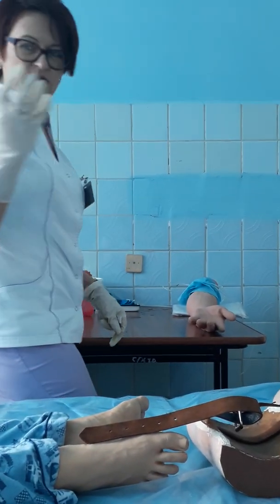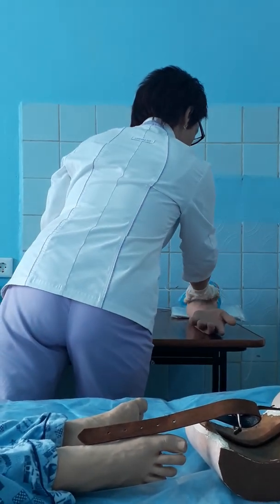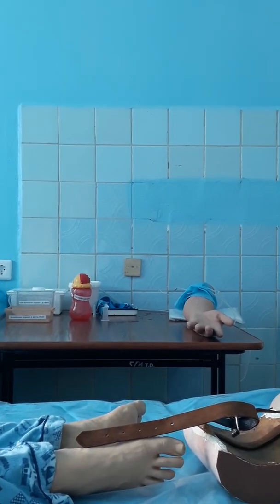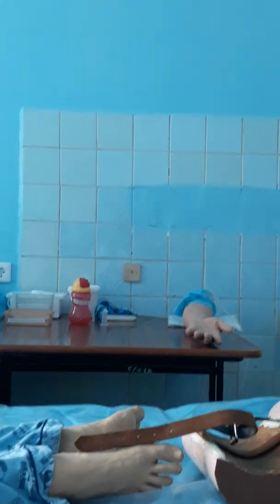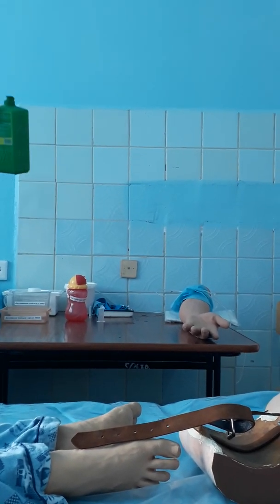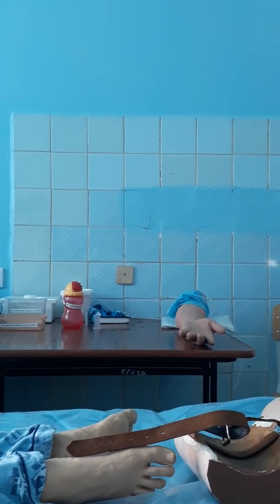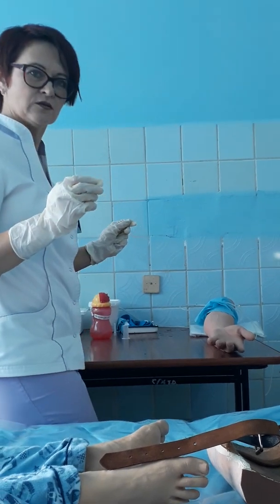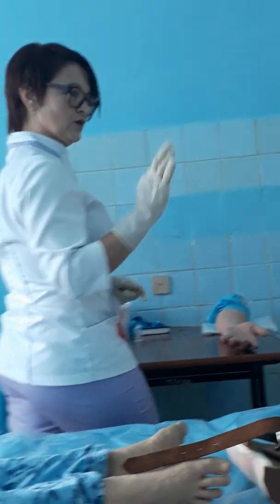Ask your patient, please compress your fist, your hand. After you palpate the venous, you start to clean. How many times do you clean it? Twice. What solution? Antiseptic solution, disinfectant for skin, Septocid. First time you clean 10 by 10, and every time you move it up.